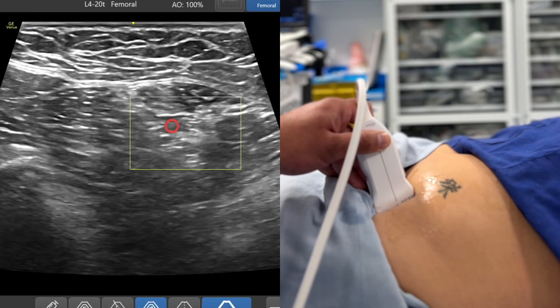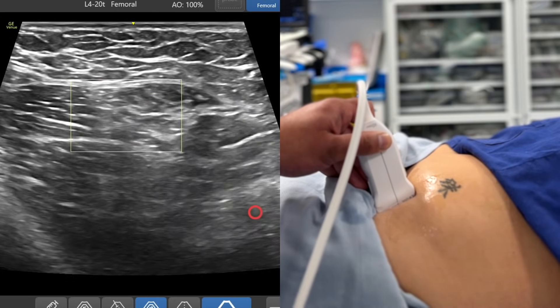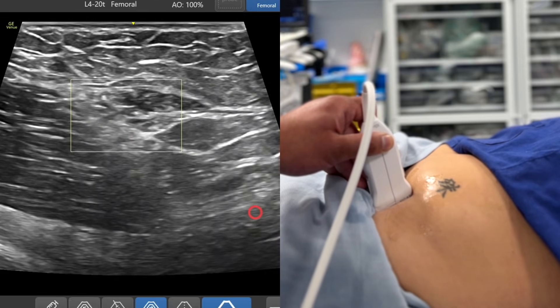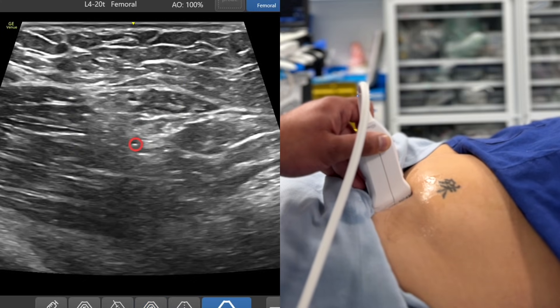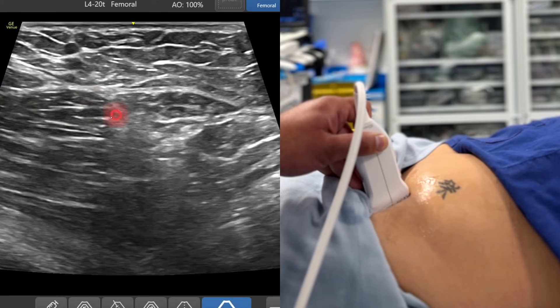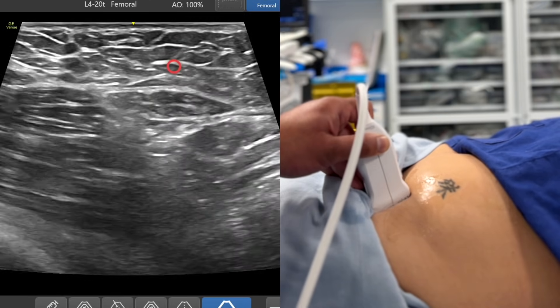If I put the color Doppler on here, hopefully we'll be able to identify the deep circumflex iliac artery, which is your ultrasound landmark. There's the deep circumflex iliac artery — you can see how it's resting on that surface of the iliacus. So when you perform your suprainguinal fascia iliaca block, as local anesthetic is deep to the fascia iliaca, you should see that deep circumflex iliac artery push up and out of the way.